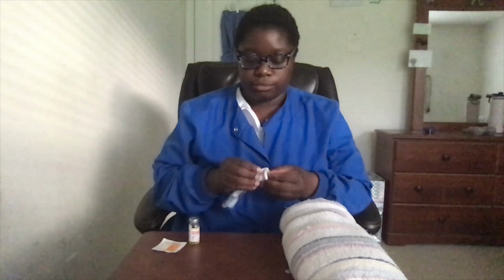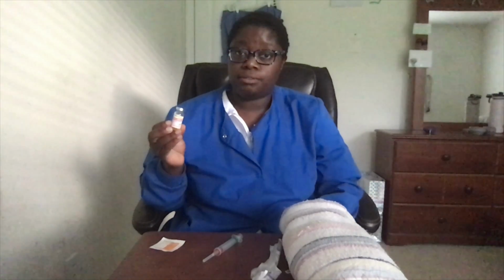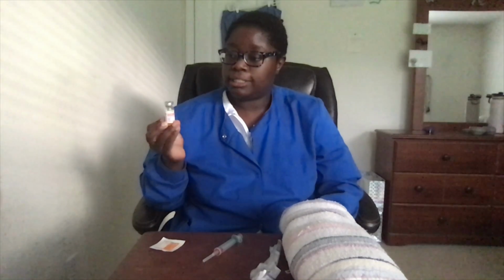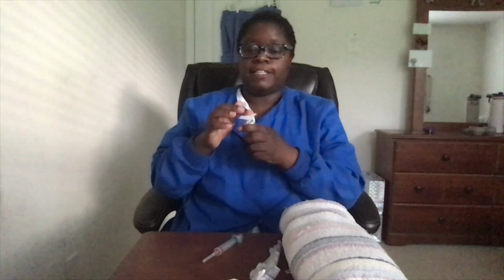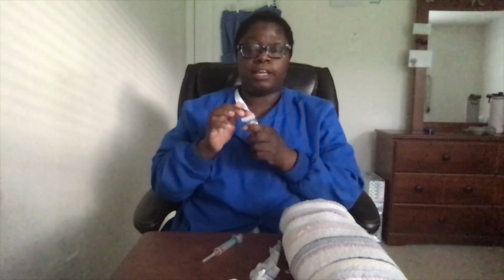Now, I'm going to actually construct the vaccine. If this were a multi-dose vial, I would have to put my initials, the date and the time of which I opened it, if I was opening it for the very first time. But this is a single dose vial, so that will not be necessary. I'm verbalizing that I have rubbed the rubber stopper for the full 30 seconds necessary and have allowed it to air dry.